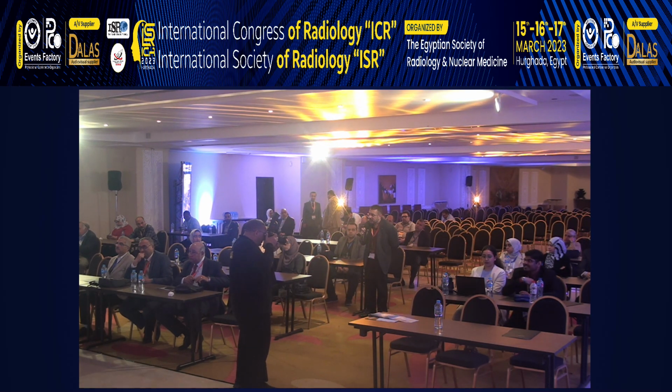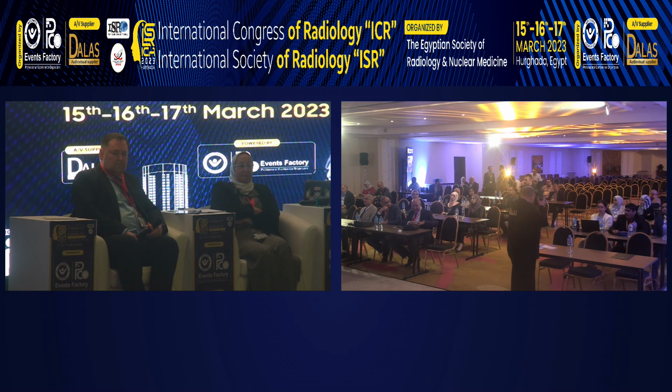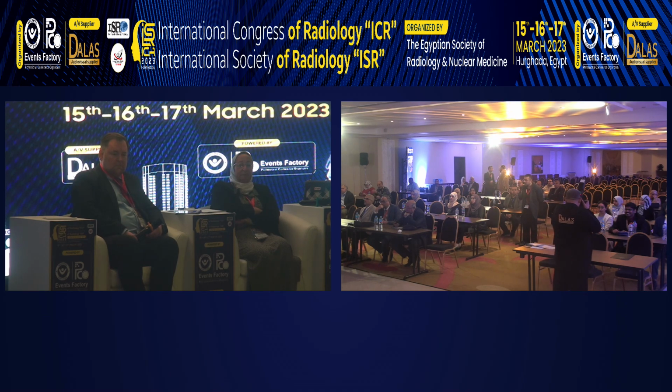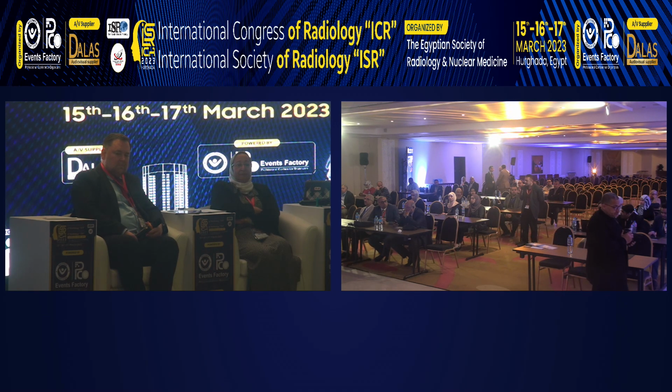We were doing liver imaging and using iron oxide to detect metastasis, exactly as you said, taken up by the normal Kupffer cells, and the metastasis will appear bright on a dark background of the liver. And then there was a lot of literature about using them for lymph nodes in different aspects. Now, my question to you, first of all, you mentioned that you need to bring the patient back like 24 hours later. Is this correct? Or is it the same day, like 6 hours or something?